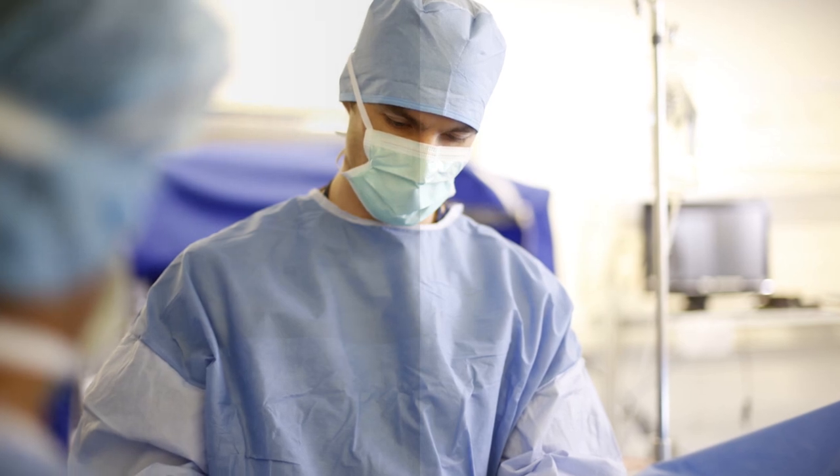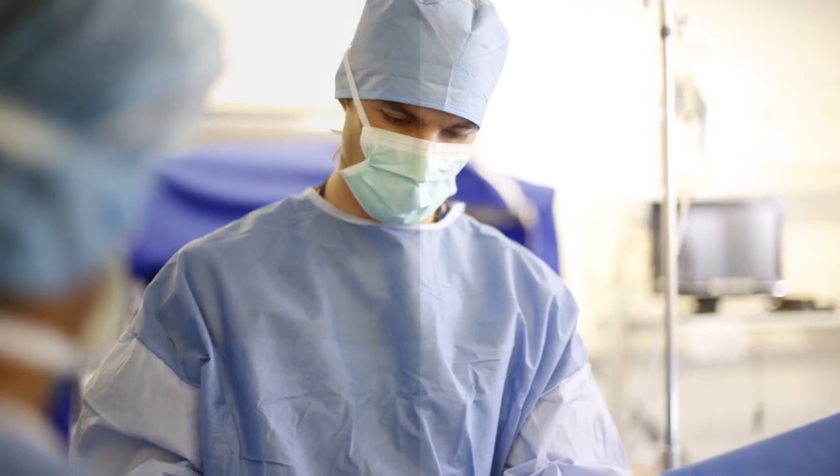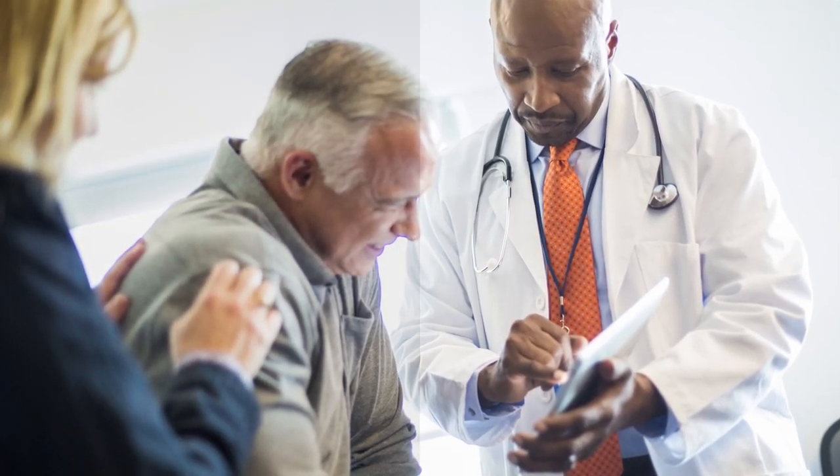Have you ever had to delay surgery because the uretroscope you just opened, direct from reprocessing, is not working properly?